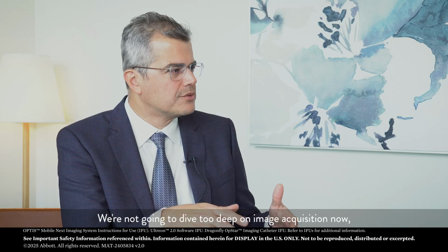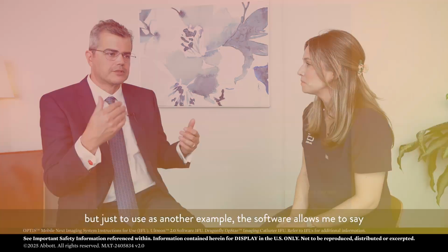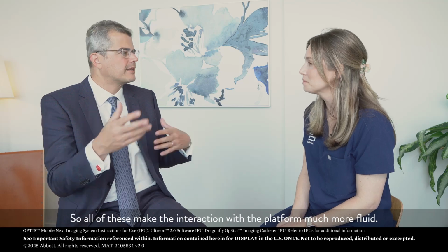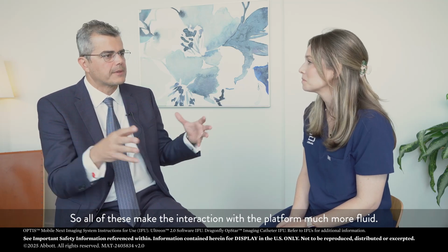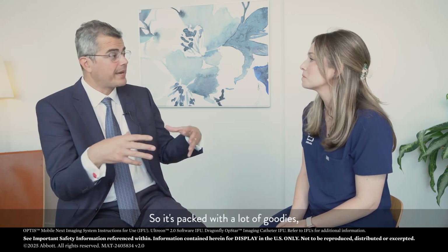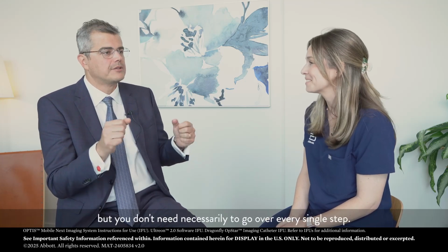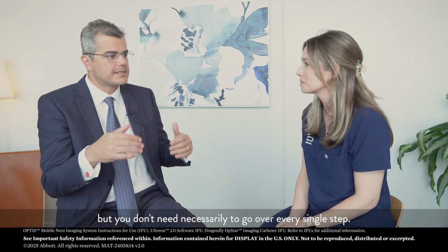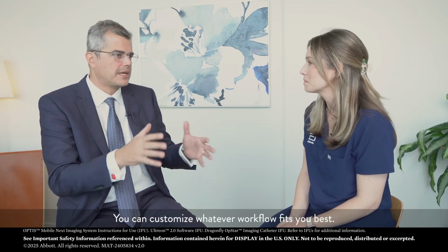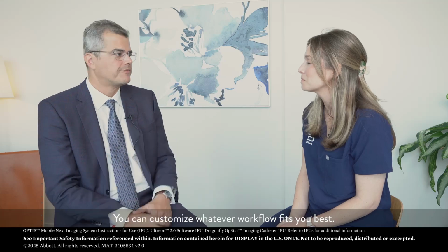We're not going to dive too deep on image acquisition now, but just to use another example, the software allows me to say I want automatic trigger or manual trigger of the pullback. So all these make the interaction with the platform much more fluid. It's packed with a lot of goodies, but you don't necessarily need to go over every single step. You can customize whatever workflow fits you best.